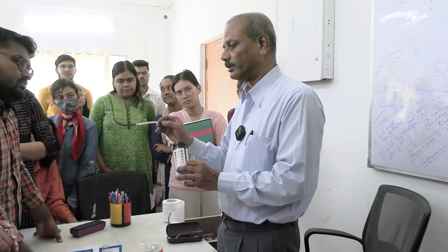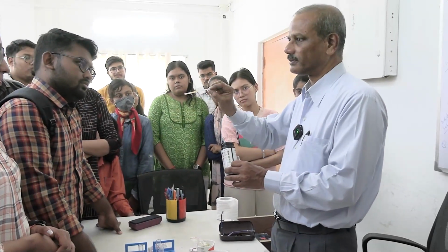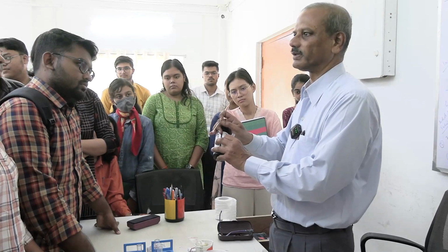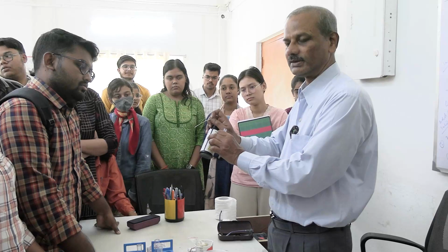That time is important because this is an enzyme impregnated strip. If you allow more time, here also you will see the color will change from the original green. If you allow the time to pass, it will come to 4+. So the color matcher is there, so you can match the color.